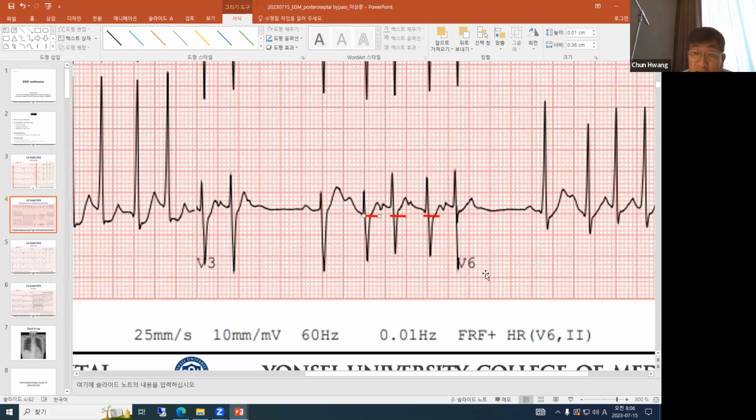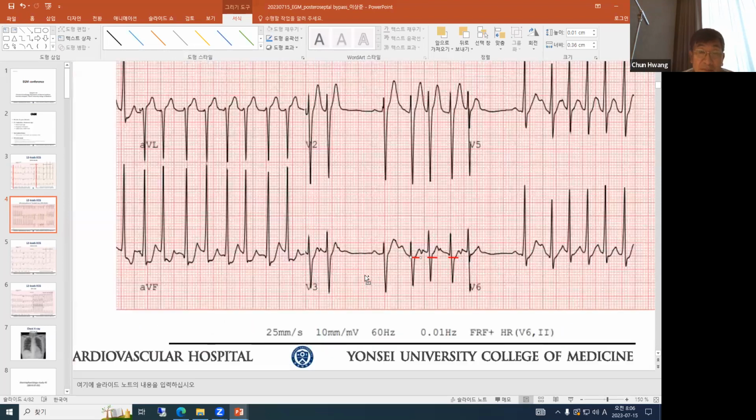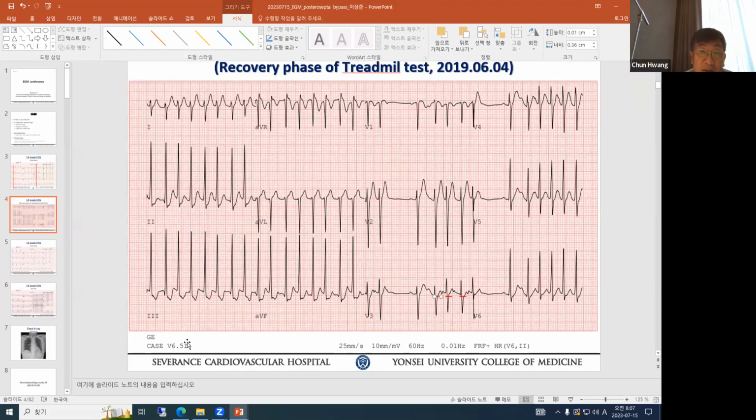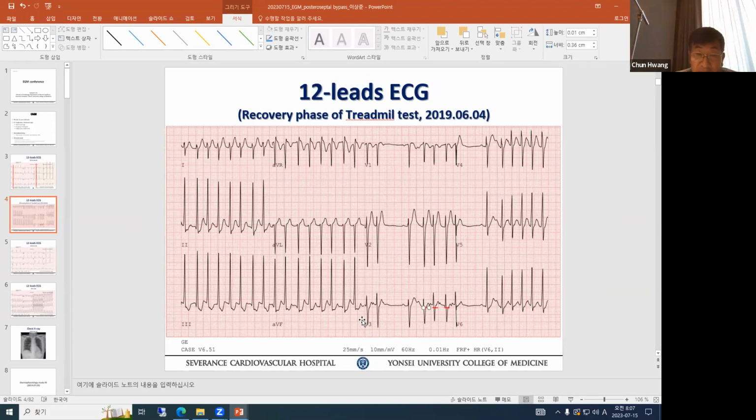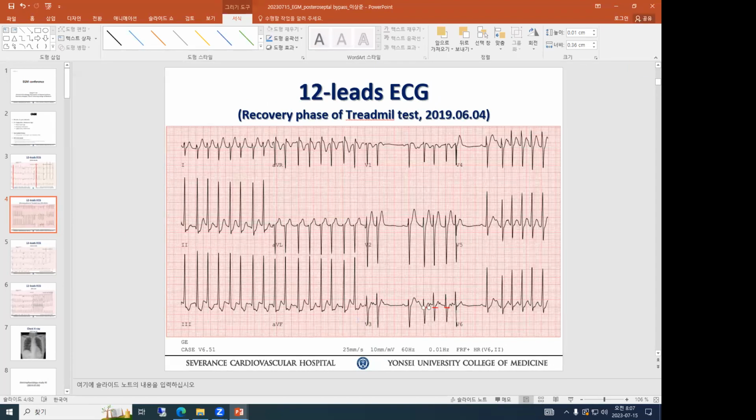근데 during the tachycardia sustain 할 적에는 그 P wave가 안 보여. 봤어? 프리코델 리드에도? I cannot see it. 다른 애도 봐봐. 아무 데도 없어. 그래서 distinctive한 P wave가 거기만 있어. So I would say this is a focal tachycardia, non-sustained tachycardia. It is possible because of your ongoing tachycardia during the exercise, and then you have this activity going on during the treadmill. So, okay, again, that's what I see in EKG. So make you think, at least. Okay? Great, 넘어갑시다.